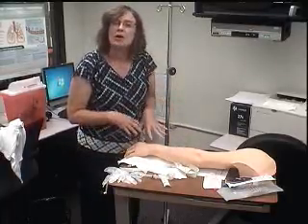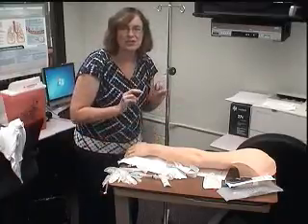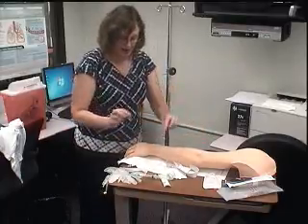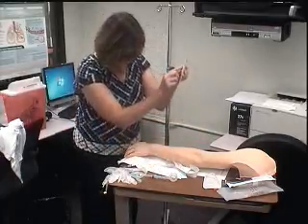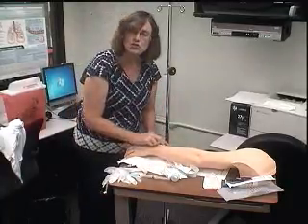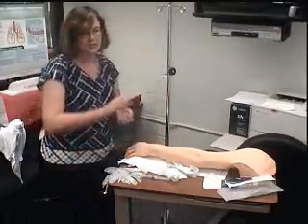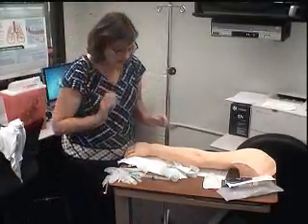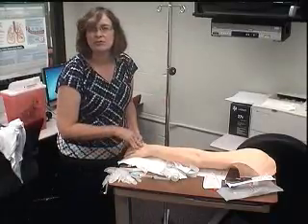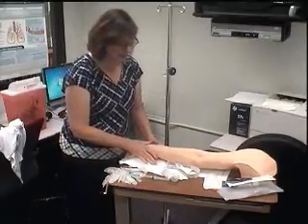Because it's really not just about what they look like, it's about how they feel. Do they feel like they have juicy blood in them? Is it straight? Is it long enough? Will I be able to get it in? If you look, this is a 1 1/4 inch catheter, so I have to have a vein long enough and straight enough to get that catheter in so it doesn't twist and turn and bend. I'm going to try and go most distal unless I can't. Let's say it's a really old person with really fragile veins and I can't use their hand. But I'm going to try. That's going to be my attempt.